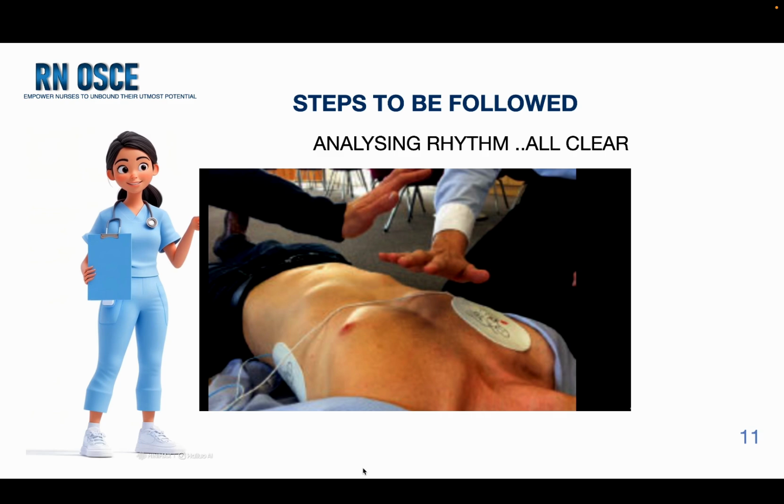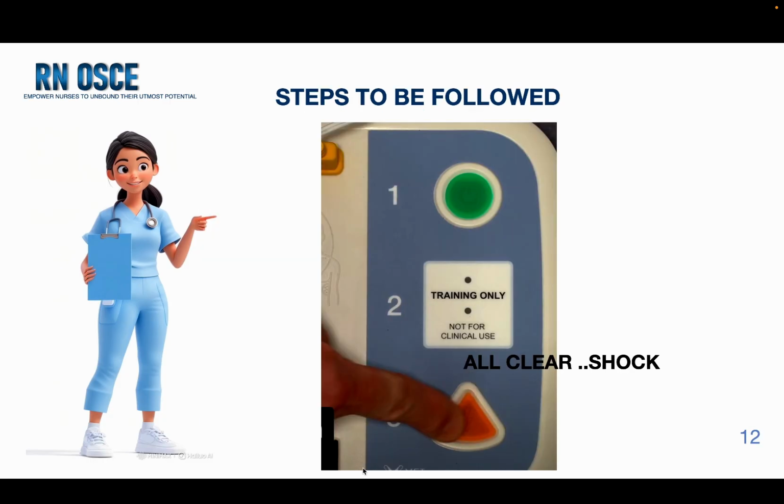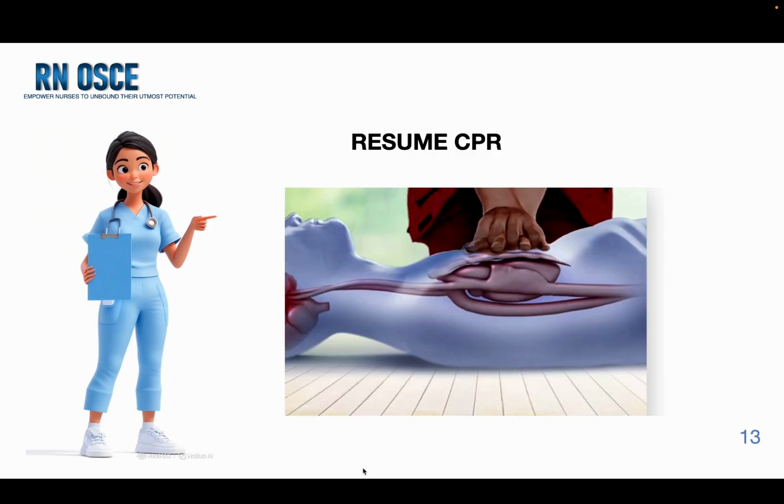If a shockable rhythm is detected, the device will charge. When prompted, press the flashing orange light button and ensure that no one is in contact with the patient. You are supposed to resume CPR immediately after delivering the shock. And if the AED advises no shock required, also resume CPR without delay.